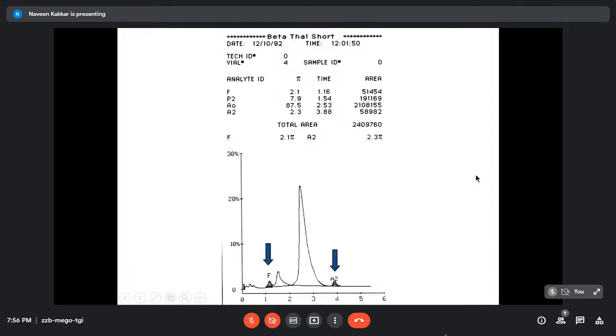If you are looking for a hemoglobin disorder, I am not worried about the glycosylated hemoglobin. Let them be. But if they are coming out to be, say, 12 or 15%, then you might even be picking up a diabetic just by chance. If you go to biochemistry and they are using the A1C program, their instrument will highlight the A1C and will not give you the measured or shaded portion of the others. So basically, the program you are using will highlight what you are looking for. Again, F, A2 and A0 are your main peaks, and A0 plus P2 is actually your total hemoglobin A.